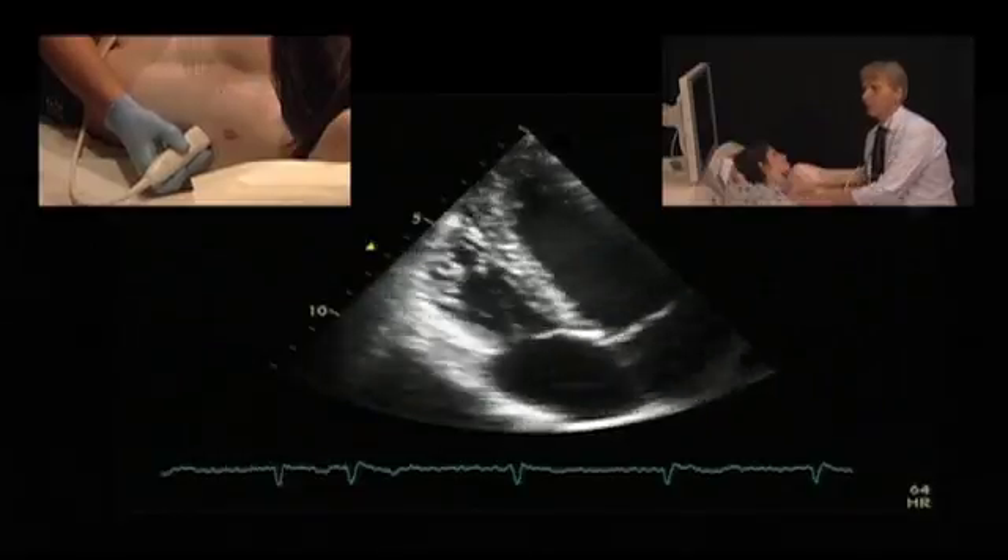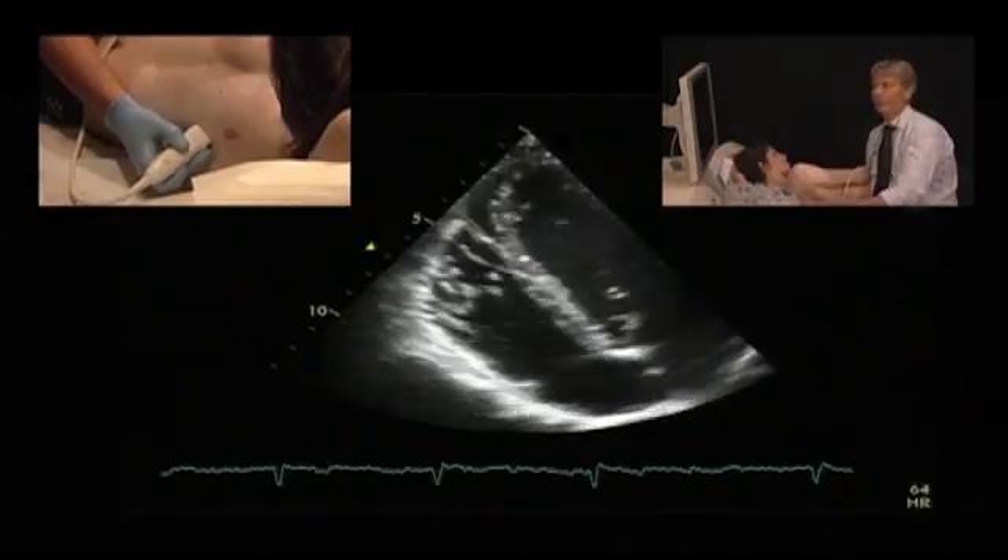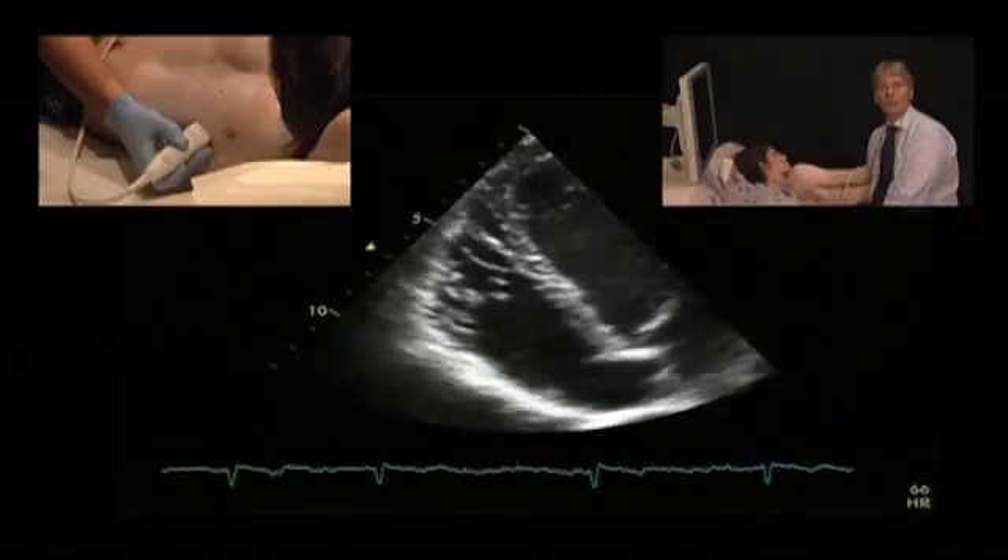So this is the view that you can use if you really want to look at the right ventricle and to assess function, size, and further other things.